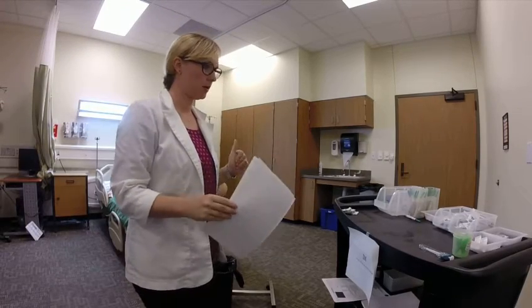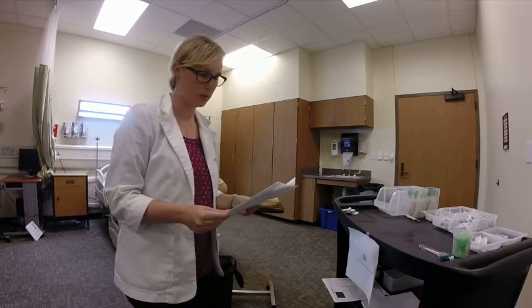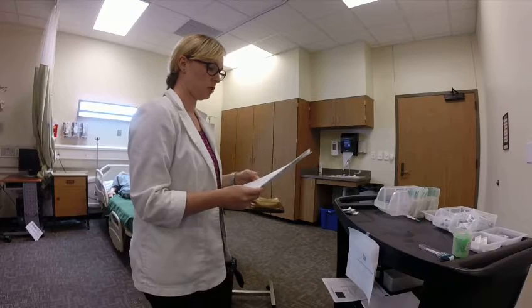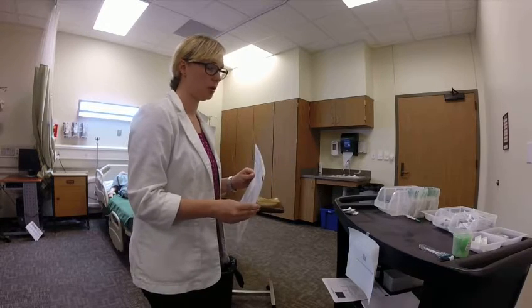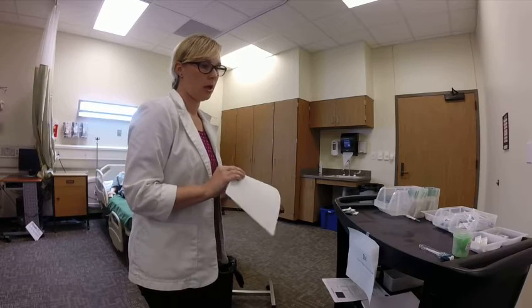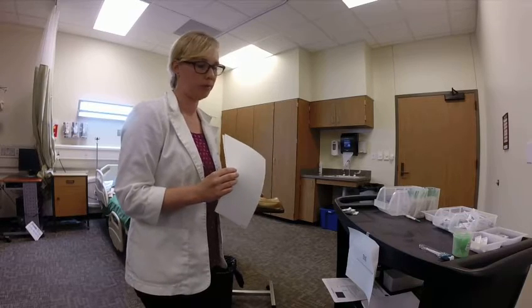I'm going to do a real quick demo of IM injections. This is not a professional video — it's me by myself, so don't judge. I'm going to demonstrate Rocephin, which is an antibiotic, and it is a reconstitution. I'll do the full demo for that one, and then I'll show you how to use an ampule and also how to use a pre-filled syringe.